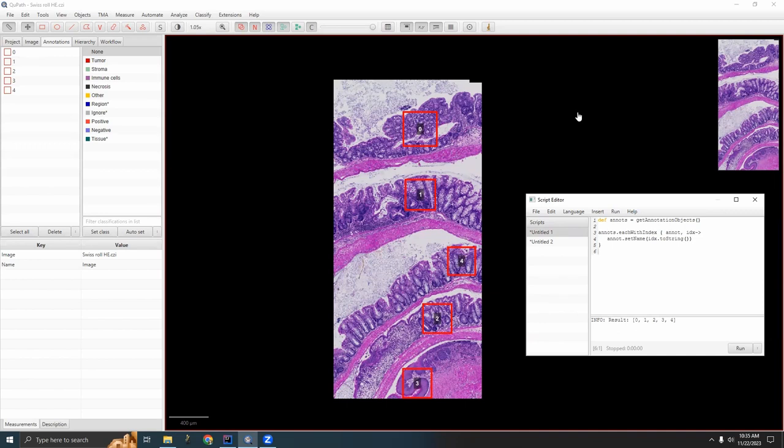And this is a really common thing that happens in QuPath. You can't assume that internally QuPath is keeping track of the order in which you made objects or the obvious order that would just make sense. Once you have this list from getAnnotationObjects, you should pretty much assume it's random. In this case, it would make a lot more sense to label them from top to bottom. So we're going to have to proactively sort this annotation list to make that happen.